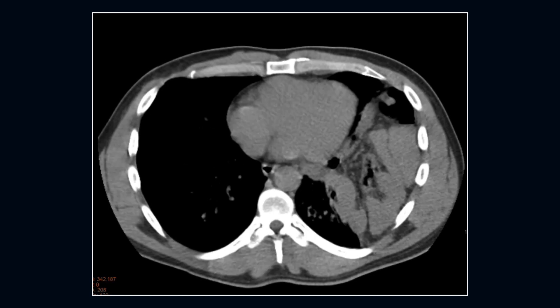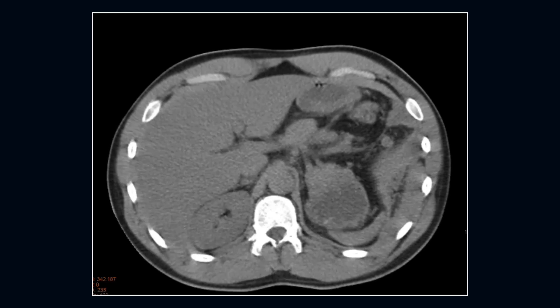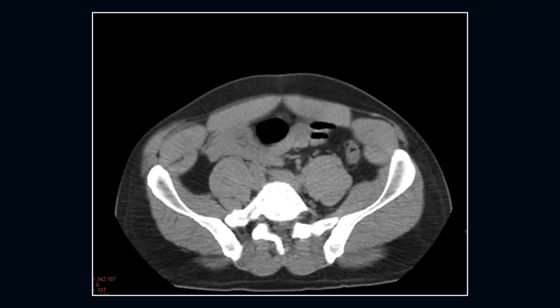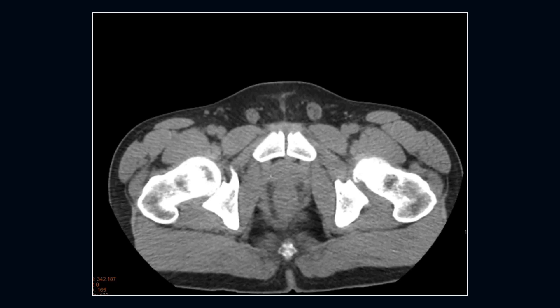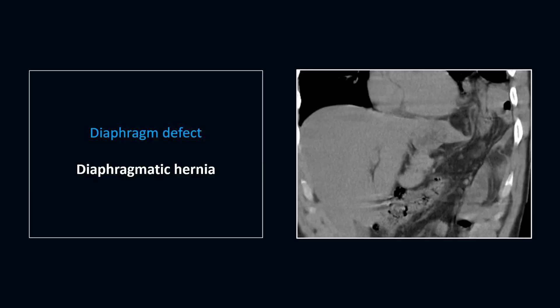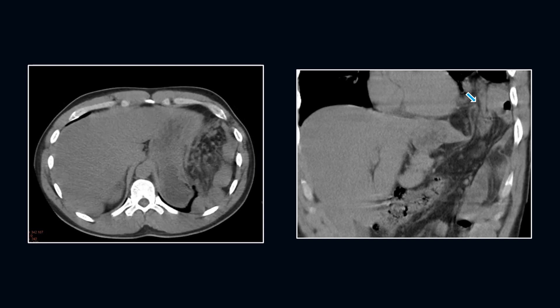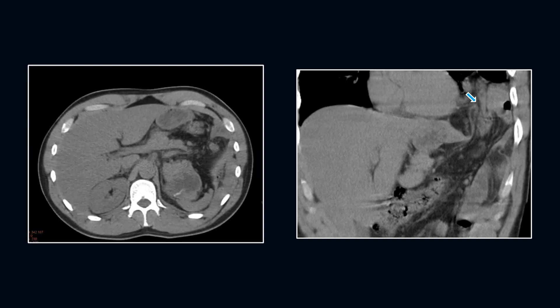Next case, here we see the abnormality is in the left hemithorax. There is a defect in the left hemidiaphragm and there is herniation of intra-abdominal fat and bowel loops into the left hemithorax — this is a diaphragmatic hernia. When we see the case again, we see the bowel loops, the fat, and the defect in the left hemidiaphragm.